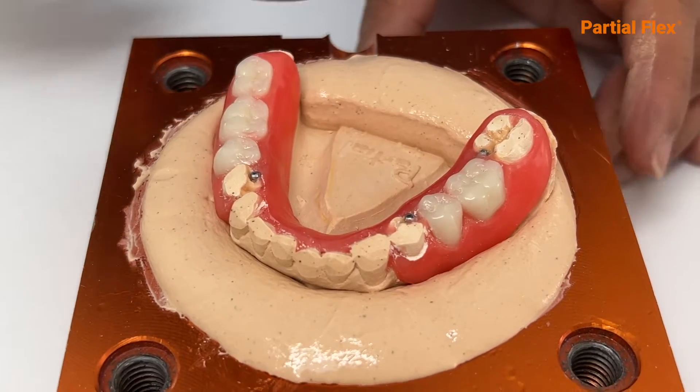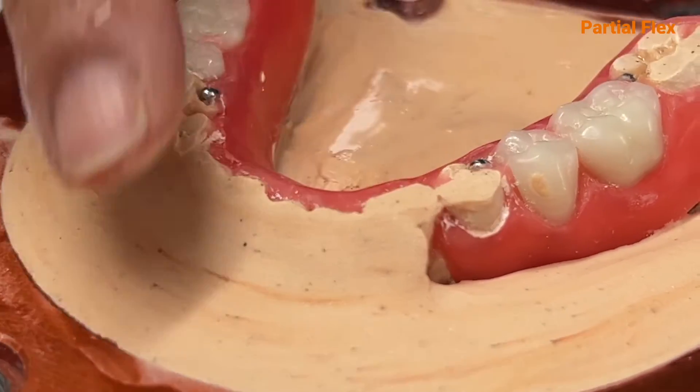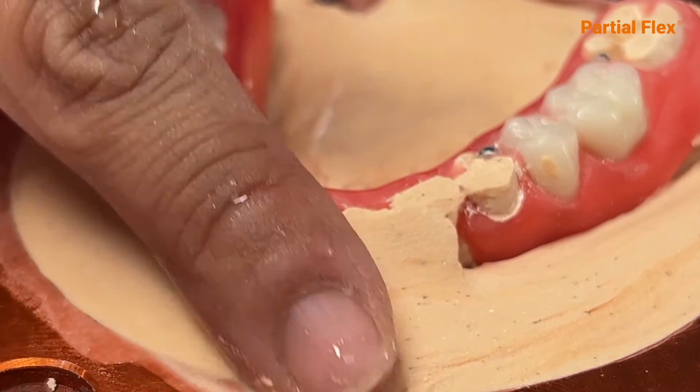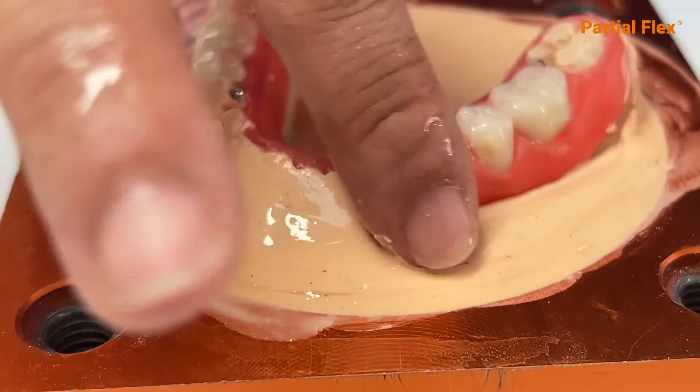Do not let it make contact with the wax. After five minutes, reduce the concentration of the mixture with a little bit of water until it turns opaque and is very smooth in consistency.